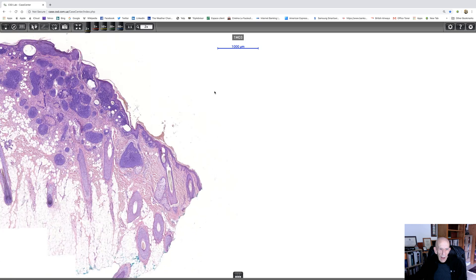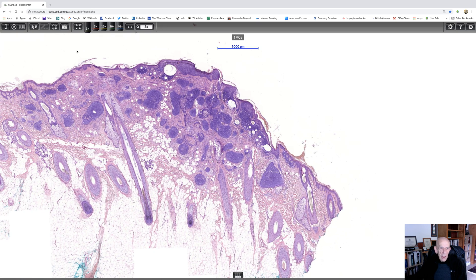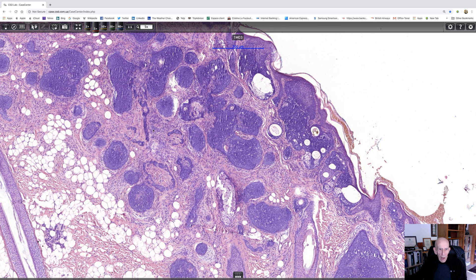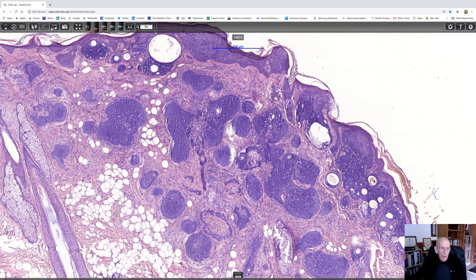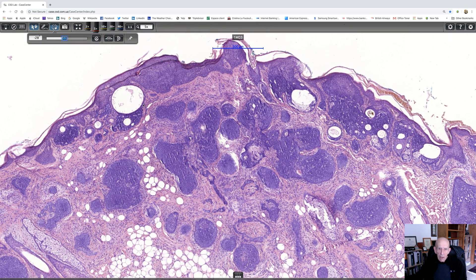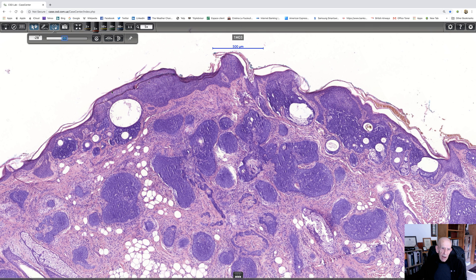One is going to be trichoblastoma and the other is going to be basal cell carcinoma. Let's have a look at high-arm magnification and see if we can decide which it is. If we look here, there's the epidermis — you can see an origin of the tumor with basaloid nests and keratocysts.